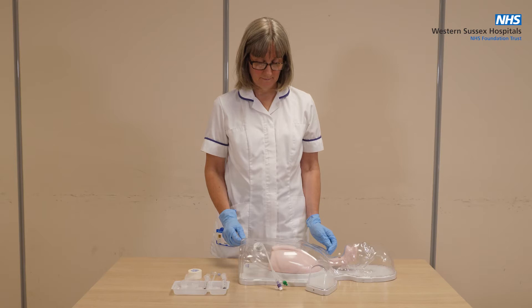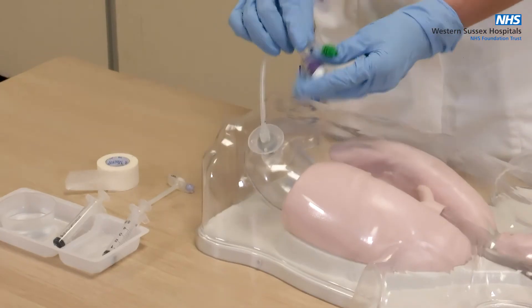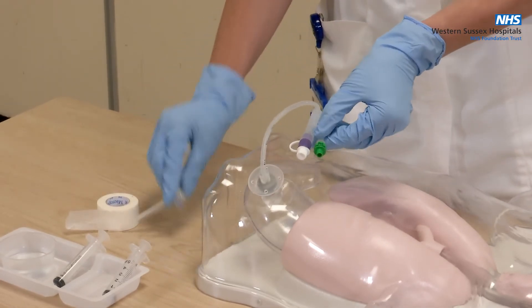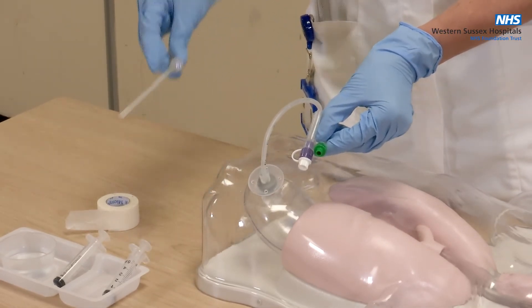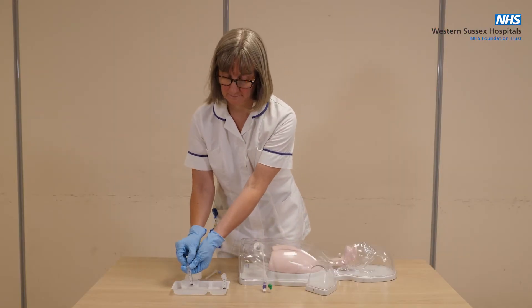Next, check the designated water volume on the water balloon. This is written on the inflation port. Pre-fill one of the Lewa slip syringes with the corresponding amount of water and set to one side.